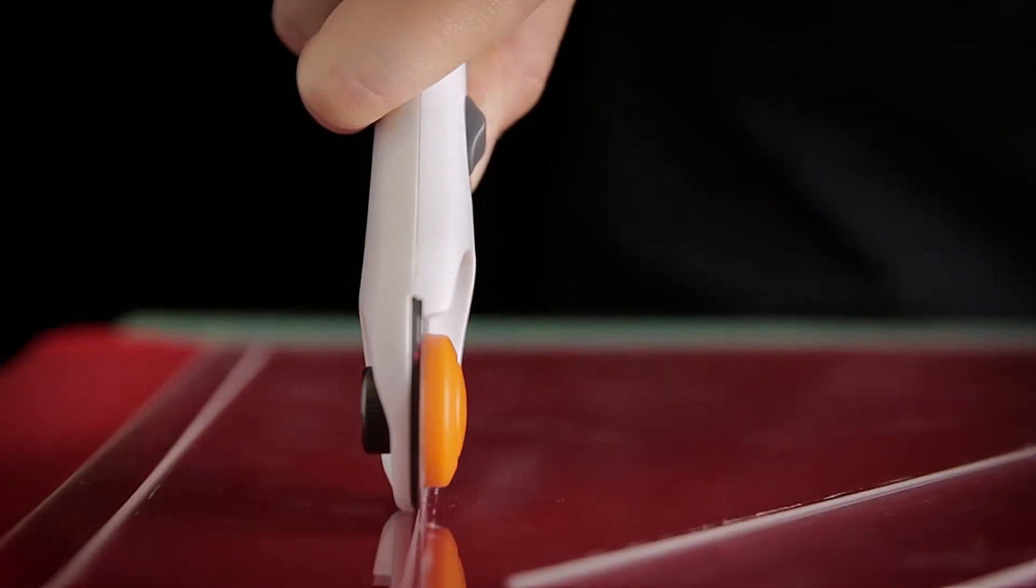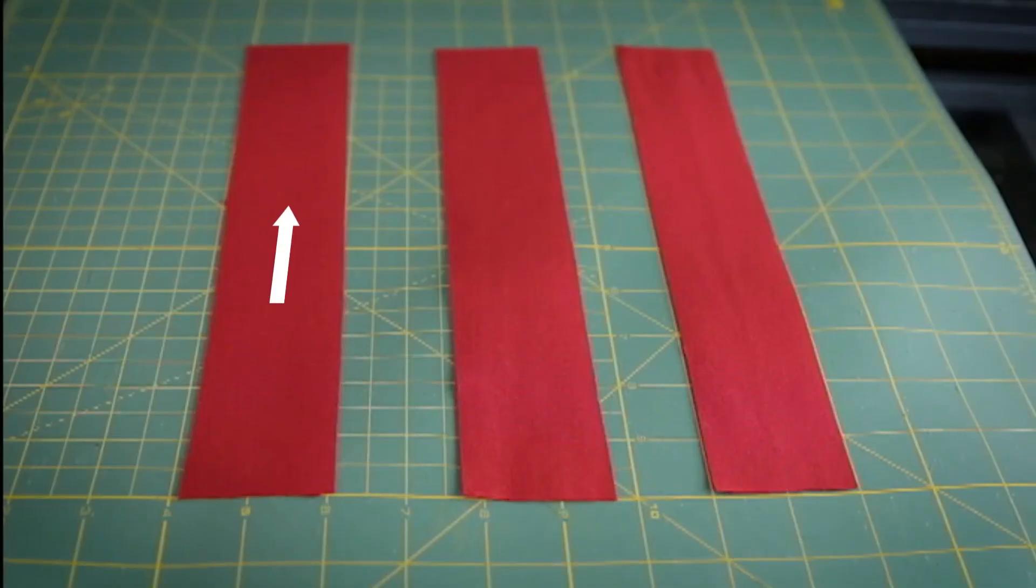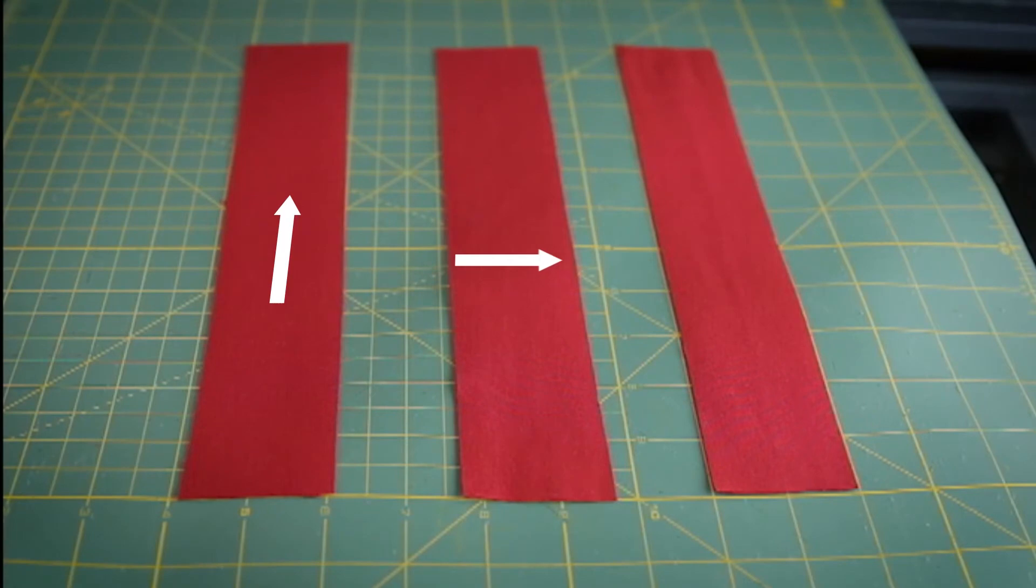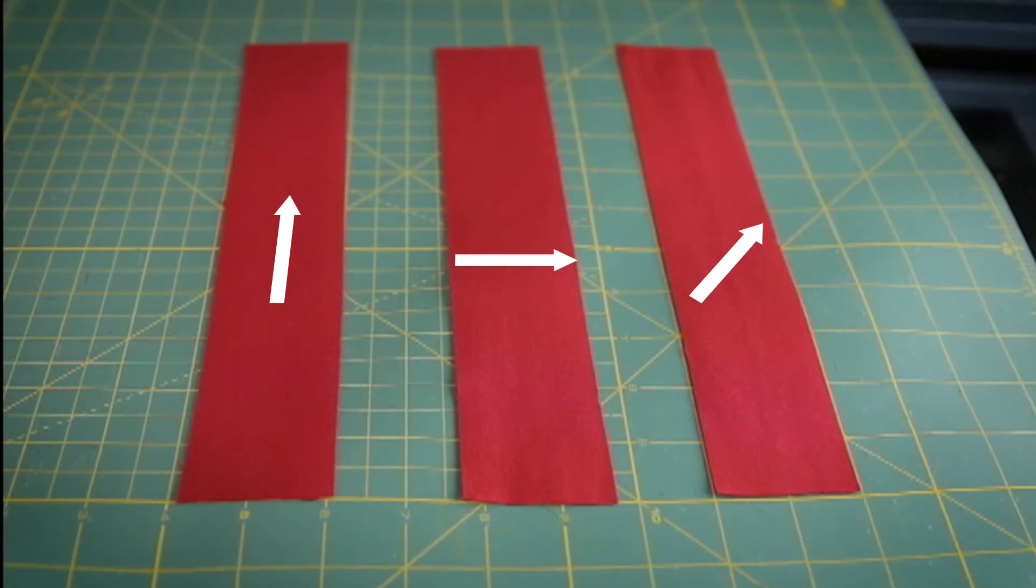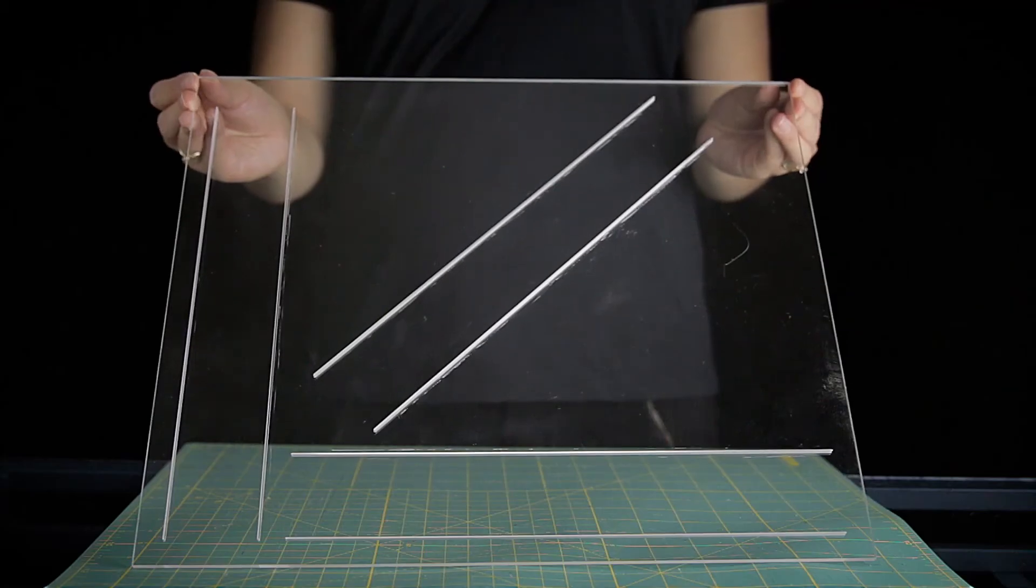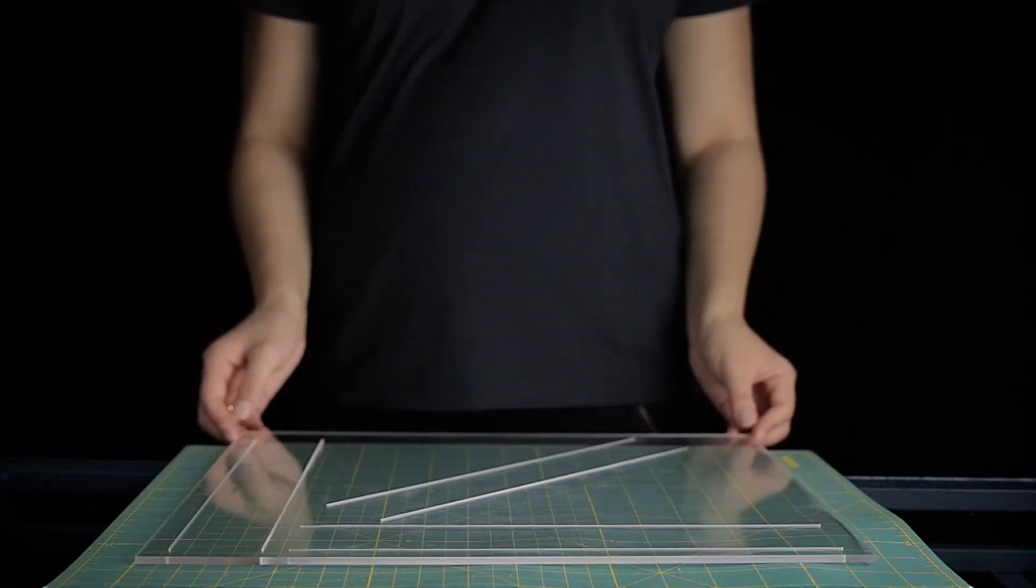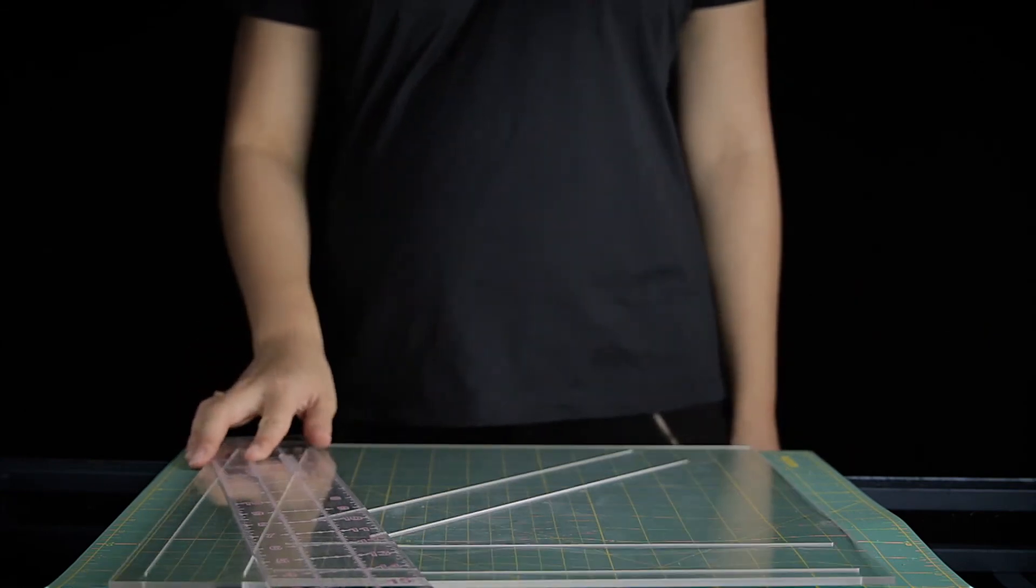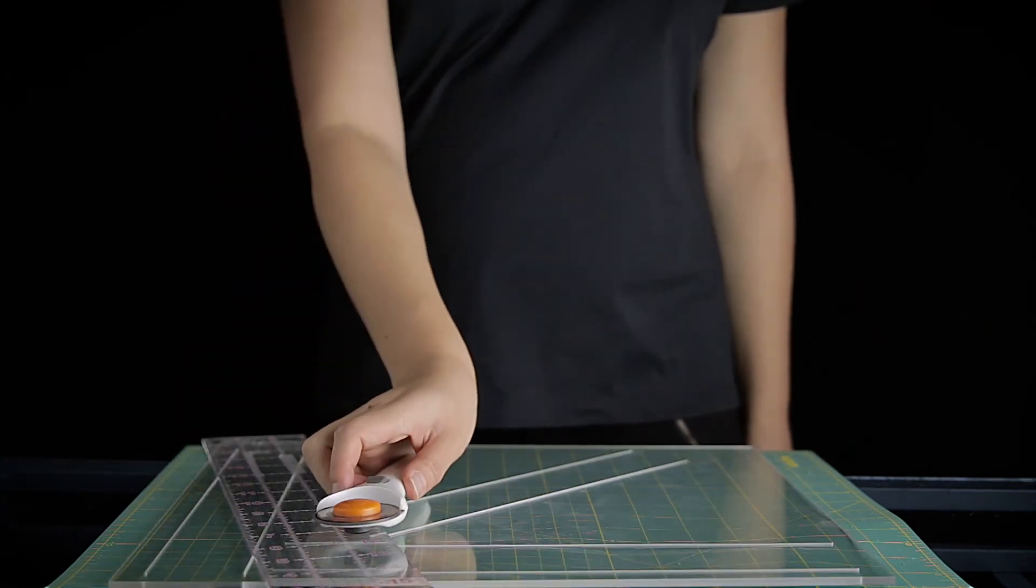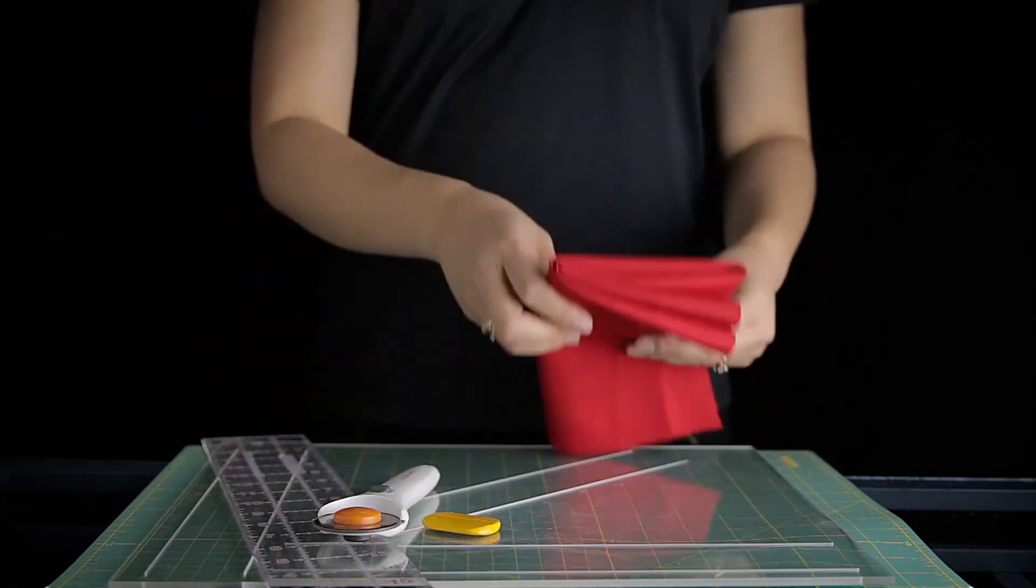Cut and mark your three sample fabric strips: a long or length grain, a cross or width grain, and bias grain. Use the cutting template to achieve accurate dimensions of 5 cm x 30 cm or 2 x 12 inches with a rotary cutter and cutting mat.